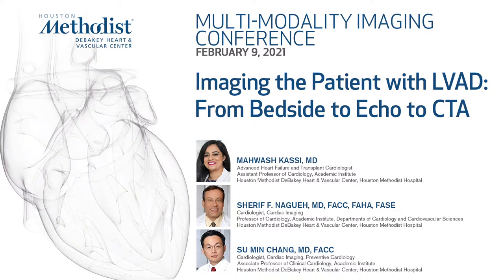The other question, Dr. Chang, is, do you monitor LVOT VTI and cannula VTI in LVAD patients long-term? I can give a brief answer, and then Dr. Chang, if you want to answer this question. Clinically, I don't necessarily rely on it. We do look at the LVOT VTI in patients who have aortic valve opening, but the LVAD cannula, as I said, can be off axis, and I really don't usually trust the Doppler waveform.